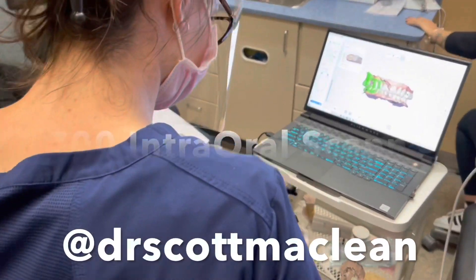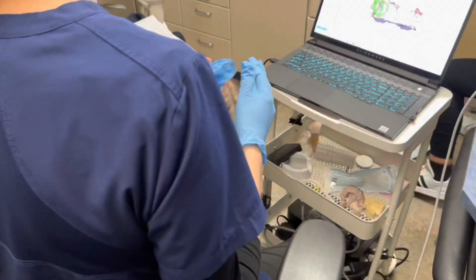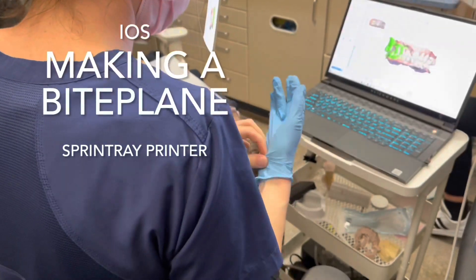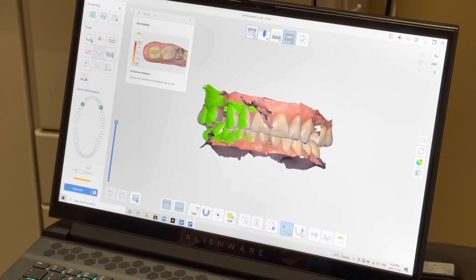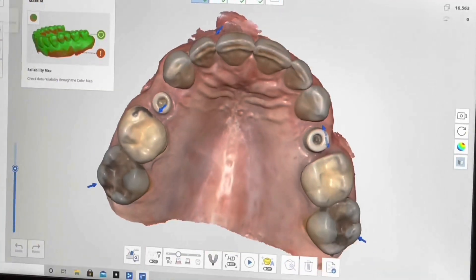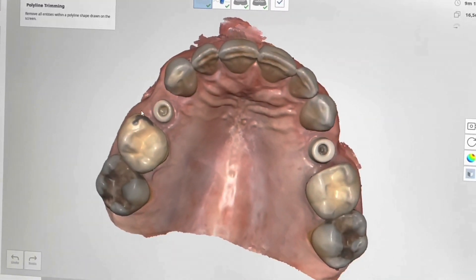Hi there, it's Dr. Scott McLean and we're going to be using the i700 intraoral scanner to make a biplane using my Sprint Ray printer. So the first thing we do — we already have a scan on the computer when we did our digital impression.